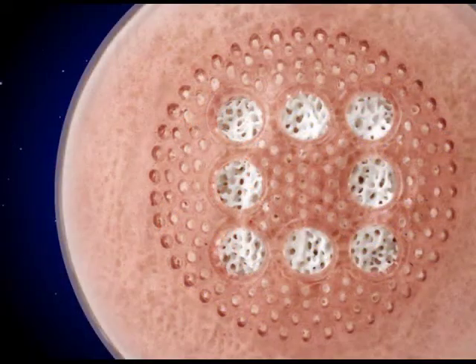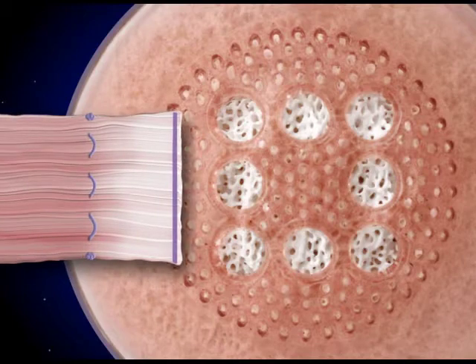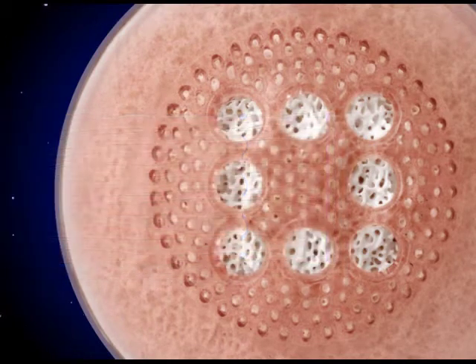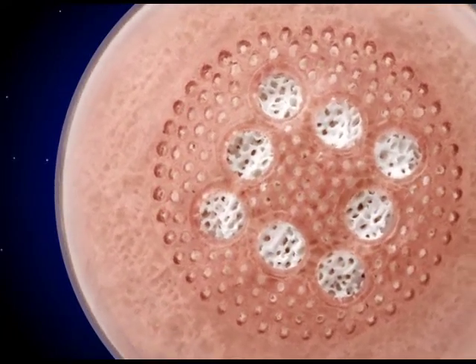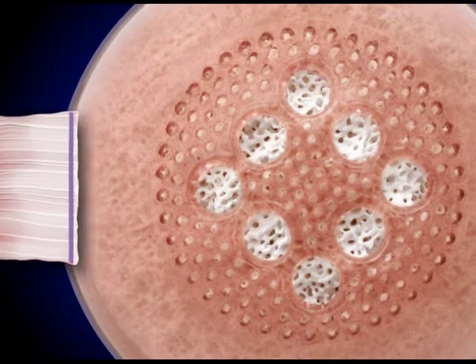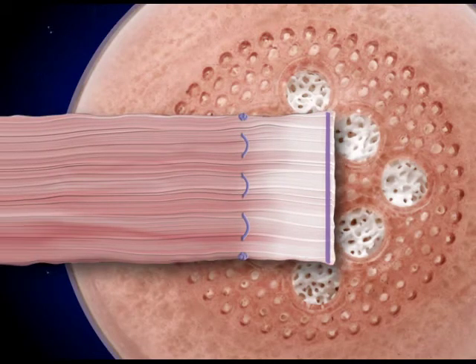The Perforated, Coated Bio-I Hydroxyapatite Orbital Implant has perforations in the amber-colored anterior portion of the absorbable polymer coating. This allows the surgeon to suture the rectus muscles directly to the implant. There are several different ways the muscles can be sutured to the implant, and this animated video will show two of the preferred methods.